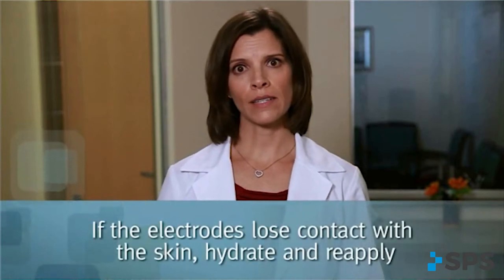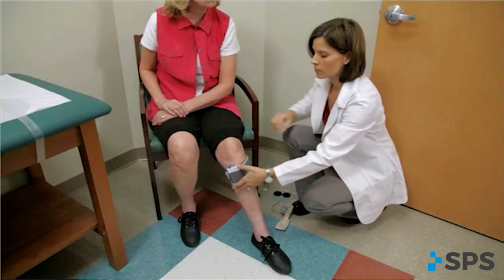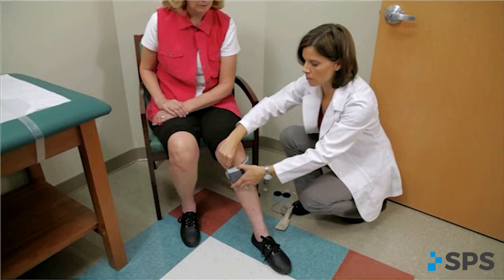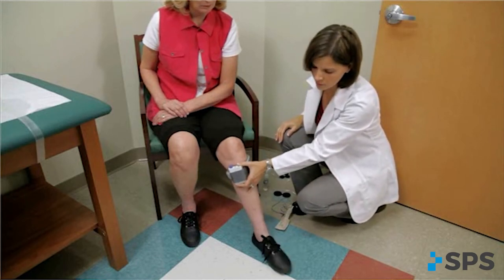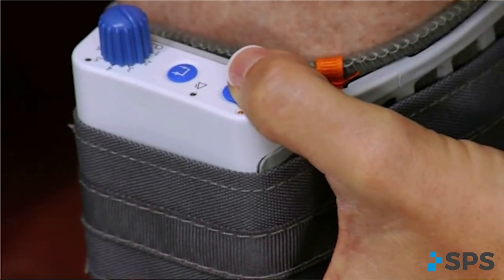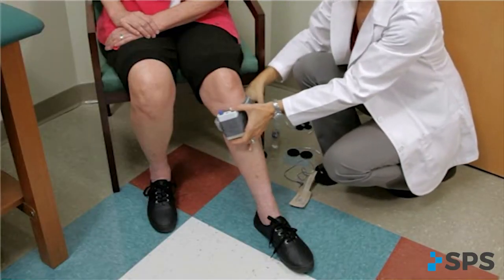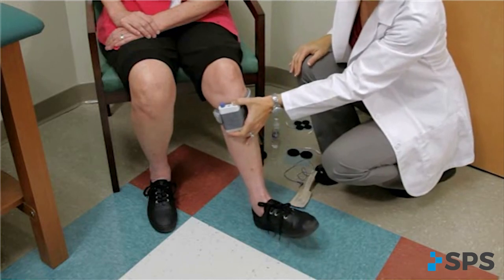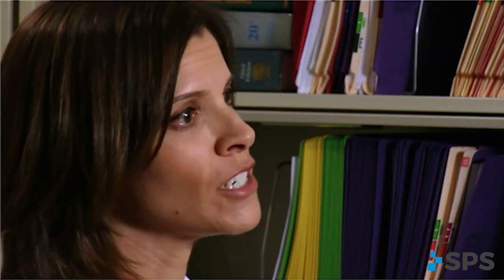If the electrodes lose contact with the skin, re-wet and reapply. Evaluate functional foot movement during sitting and standing before asking the person to walk, assuring a safe and effective foot lift. Responses can differ with changes in patient position due to movement of the peroneal nerve. Position the patient and their leg the same way each time to ensure consistency. A leg position in extension with the knee slightly flexed mimics the position of the limb at terminal stance when the stimulation will be initiated.